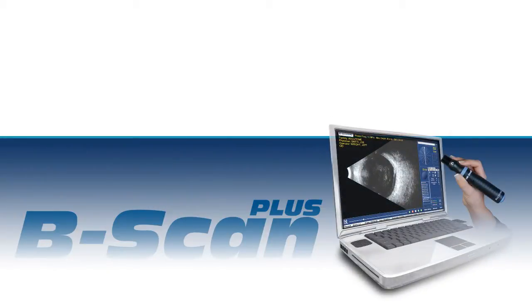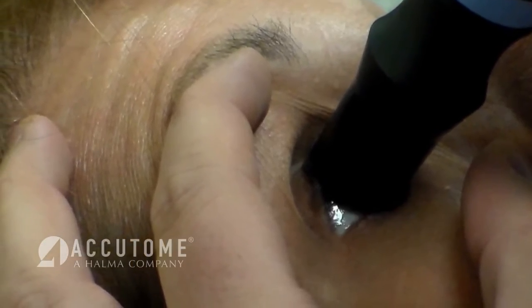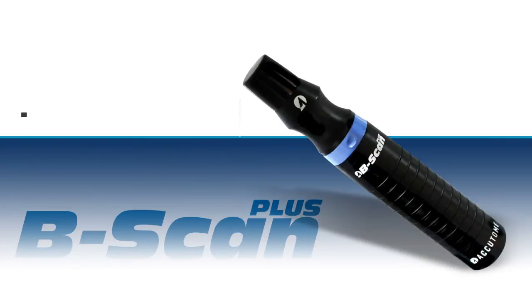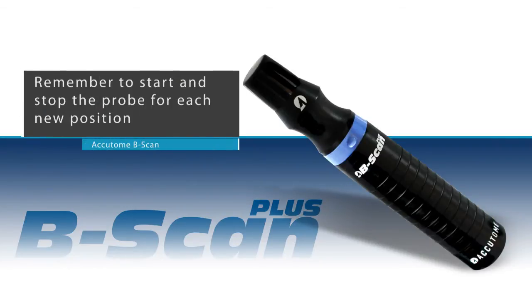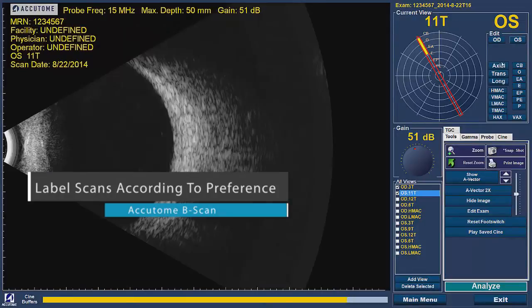Please keep in mind that if scanning a patient with an open lid, the eye must be anesthetized. Continue to scan the patient's eye using your preferred scanning technique. Remember to start and stop the B-Scan probe for each new probe position and label the scans according to your personal preference.